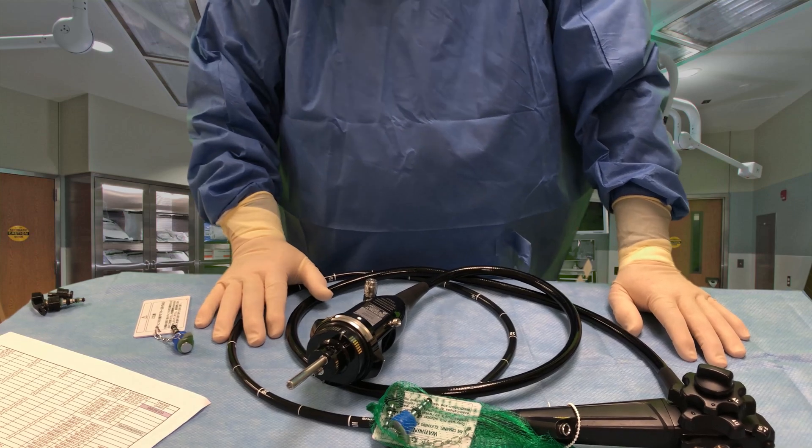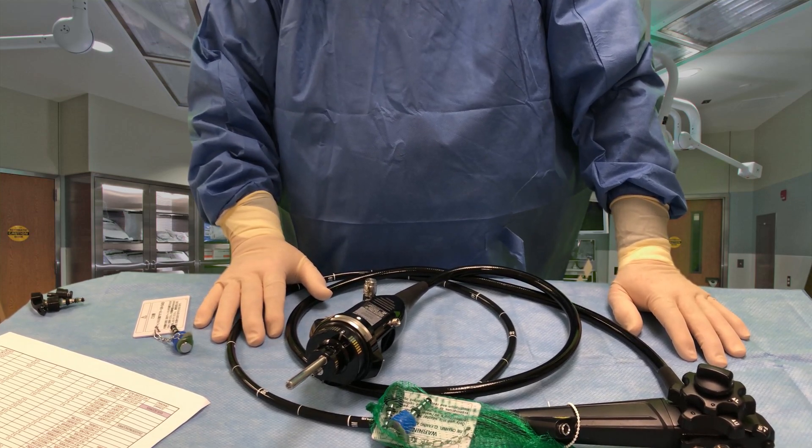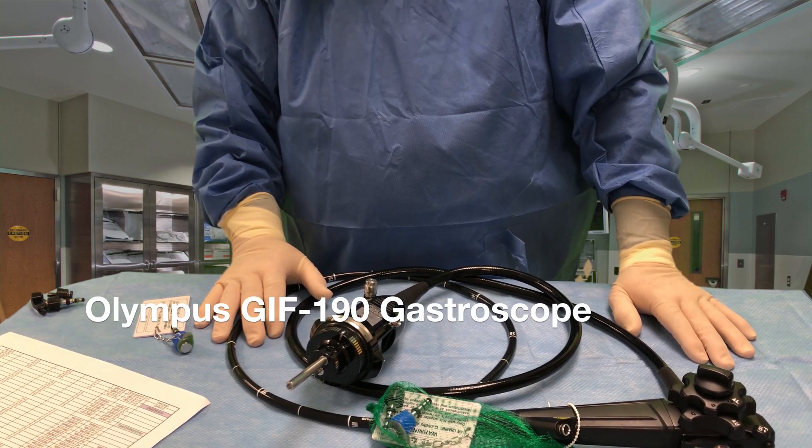Hi, I'm Steve here from the GI Department. Today I'm going to show you some of the features of the Olympus GIF H190 scope.